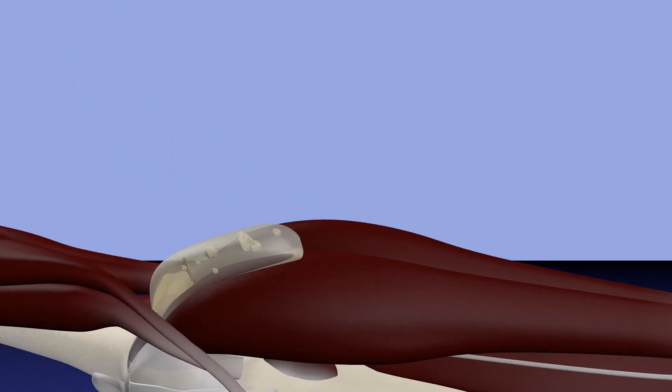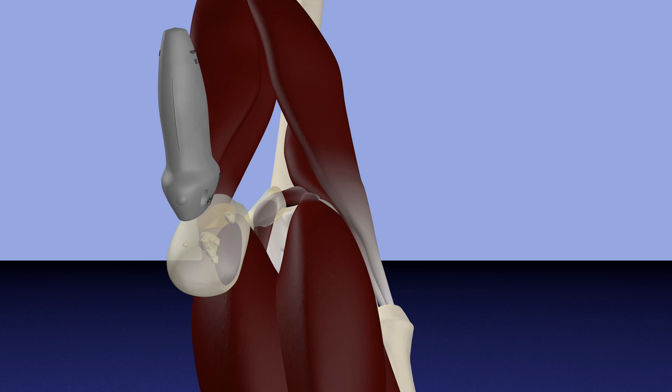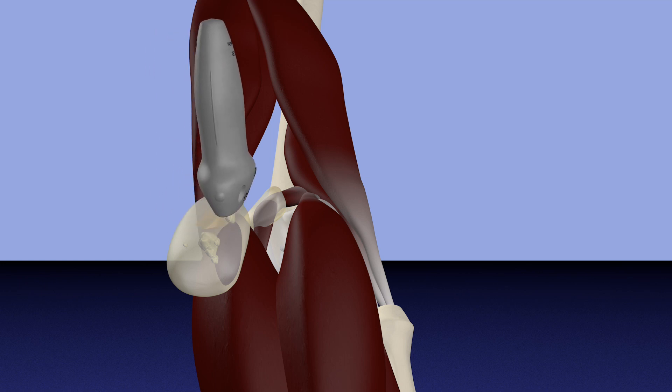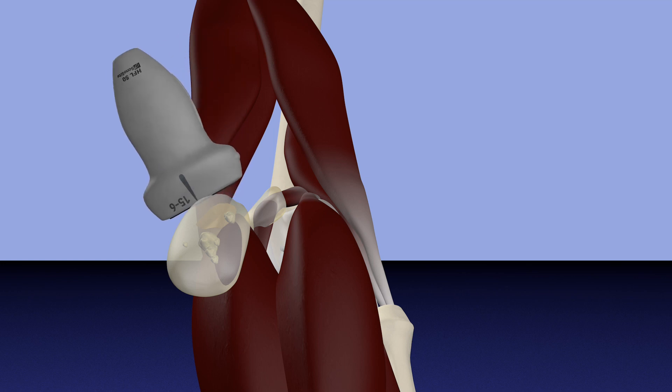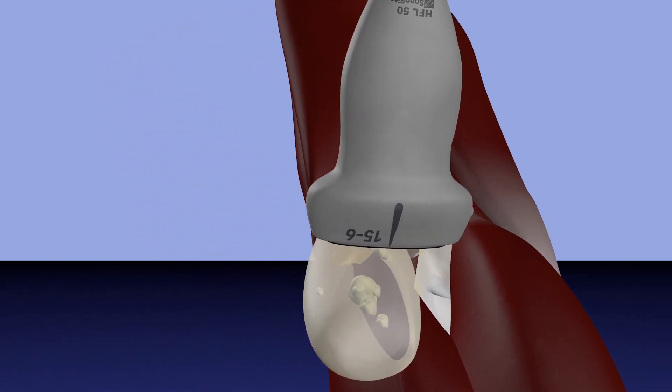Now we're putting the patient in a prone position, essentially in the position we're going to do the procedure. And again, this is what we're doing with our probe prior to the procedure to get a good assessment of the anatomy and the pathology of the Baker's cyst. In this case, this patient has several loose bodies and also a septum within the cyst as well, which you can see.